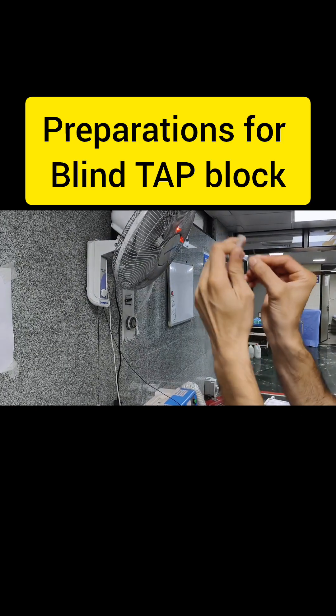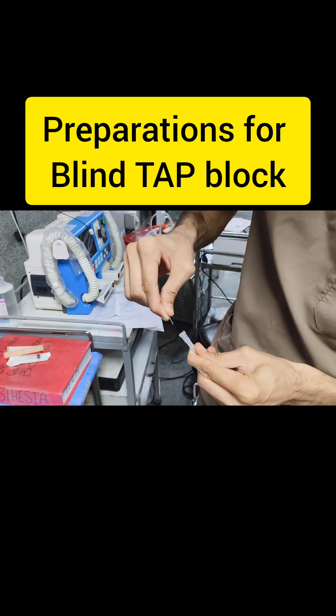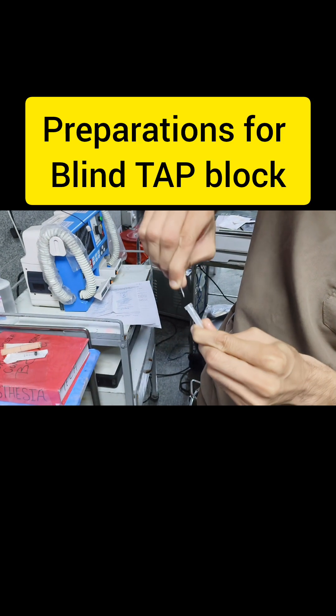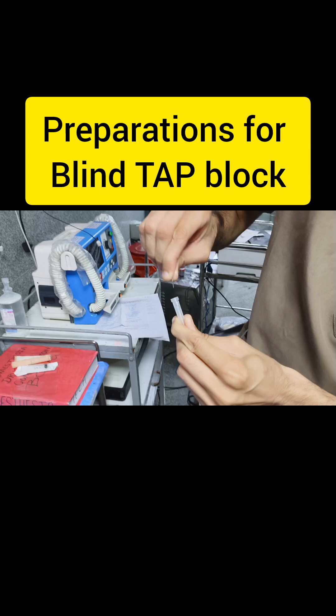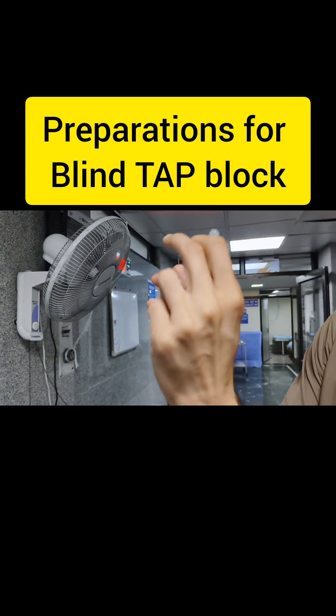Take the 18 gauge needle and blunt the needle tip by scratching the tip against the cap of the needle. By scratching it like this, the tip of the needle will become blunt and it will look like a parrot beak.